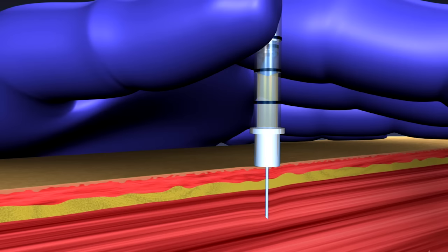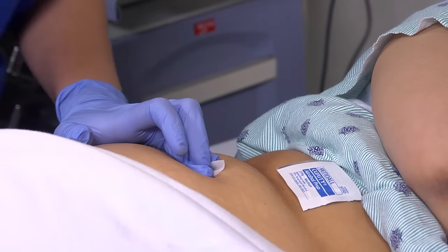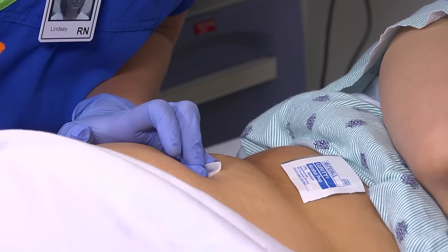If no blood appears, you're ready to proceed. Inject the medication slowly, at a rate of 1 milliliter every 10 seconds. Wait 10 seconds and smoothly withdraw the needle. Engage the needle safety. Release the skin and place a gauze pad over the site. Apply gentle pressure, but don't massage the area. Apply a bandage to the puncture site if necessary.